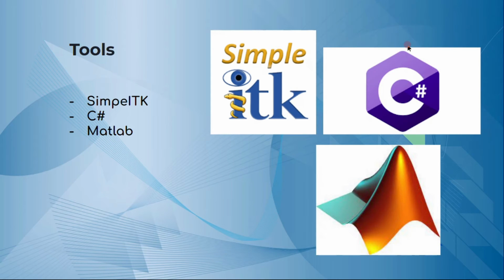The tools that I used for this project are SimpleITK, C#, and MATLAB. The SimpleITK library is used for image registration, and C# was the programming language for that. I also used MATLAB to evaluate the result.